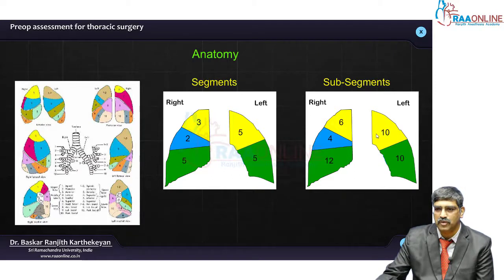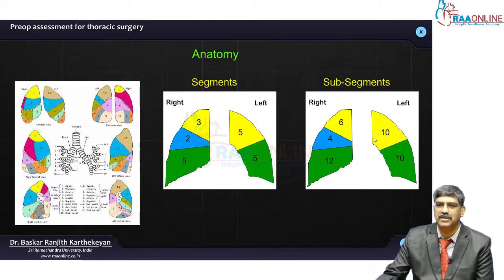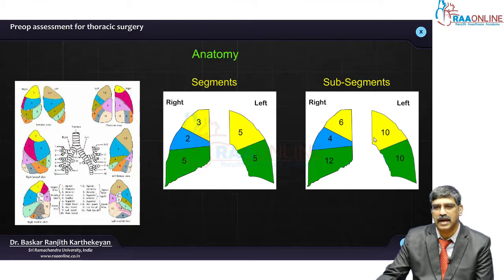Here you have 2 lobes on the left, and in the right there are 3 lobes. The right lobe is slightly bigger than the left lobe. These are all standard anatomical descriptions.